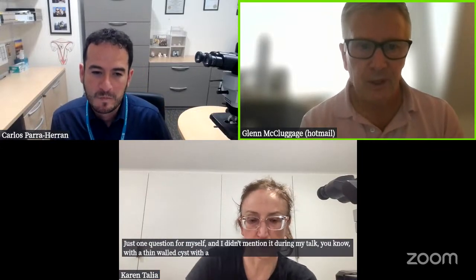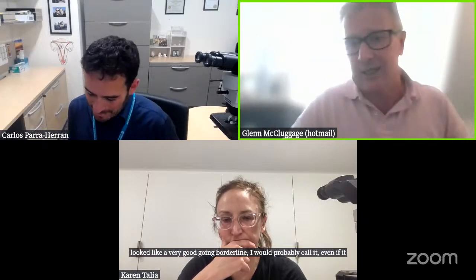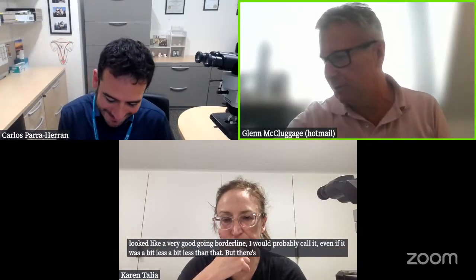Yeah, so that's fair enough. Just one question for myself, and I didn't mention it during my talk. With a thin walled cyst with papillary areas, it's probably useful to give an estimate of the percentage of the ovarian cyst that has these papillary areas. If those areas look borderline, we're always told if it's less than 10%, we don't call it borderline, although I'm not sure how much that is practiced, to be honest. If it looked very much like it was going borderline, I would probably call it, even if it was a bit less than that. But there's one other thing I want to talk to you about, Carlos.